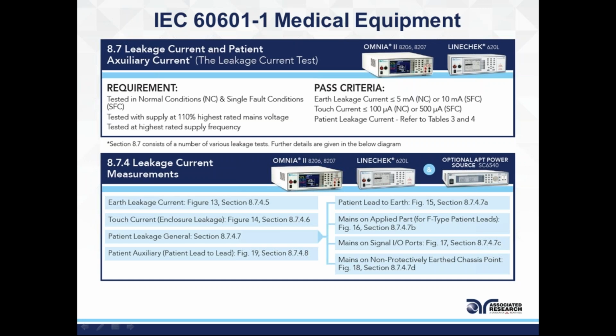So the reason they do this is to account for any kind of variation you may have, an additional line power that's not at 240 but now it's at 260. What happens to your device? Do you want your device to shock somebody because they plugged into the wall where it's 260? Your device may still operate, and at 260 is leaking a lot more current.